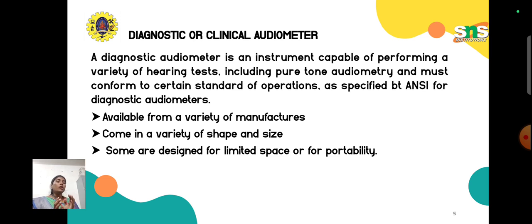It should be designed in such a way that it complies with all the standards framed for this device to come into the market or to be set up in hospitals. That is the main important point of the diagnostic and clinical audiometer.